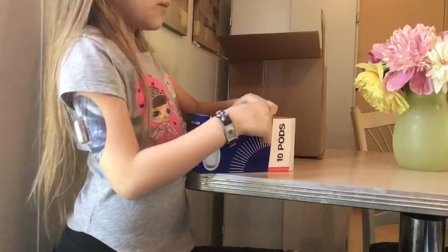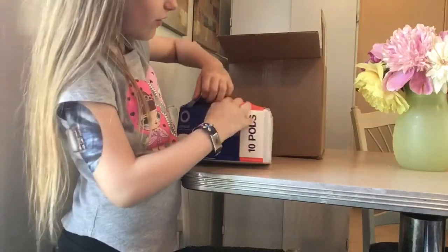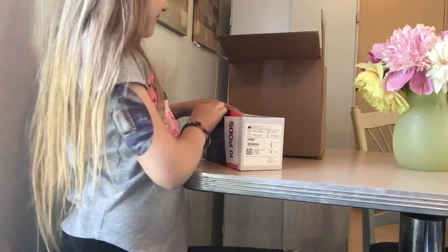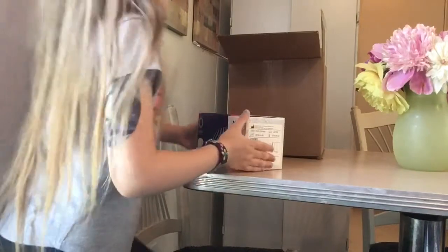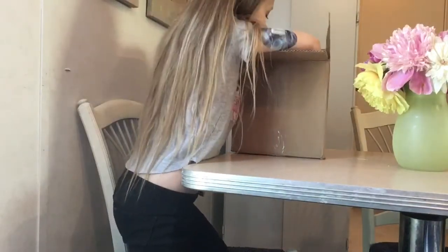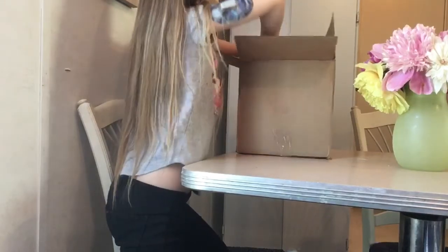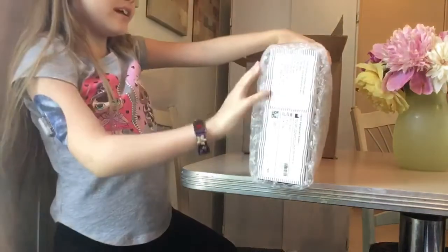In here there are more pods — these are like so cool. I'm so excited! I don't even know what's in here.